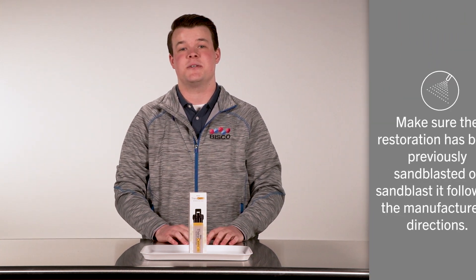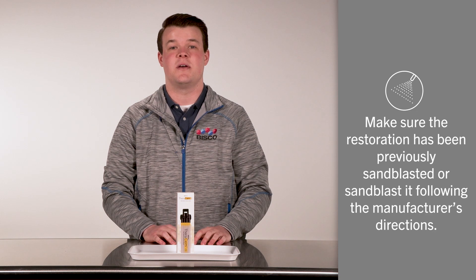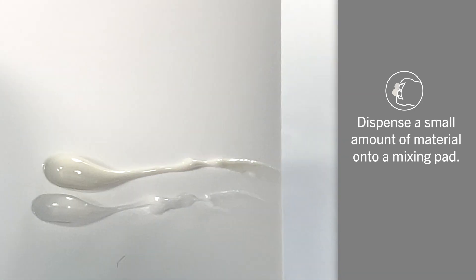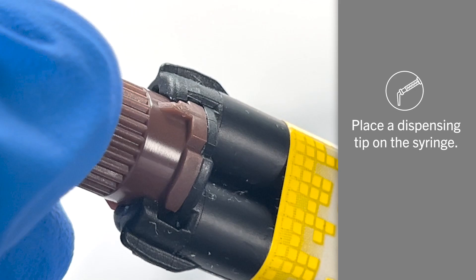Before you use Therasem, make sure the restoration has been previously sandblasted, or sandblasted following the manufacturer's directions. Begin by dispensing a small amount of material onto a mixing pad to eliminate voids, and place a dispensing tip onto the syringe.